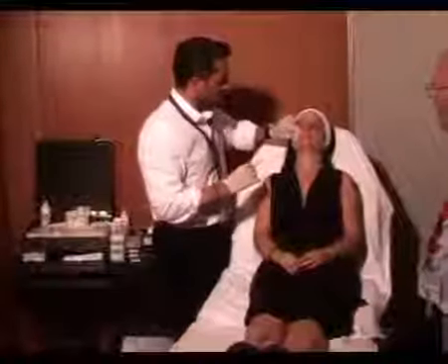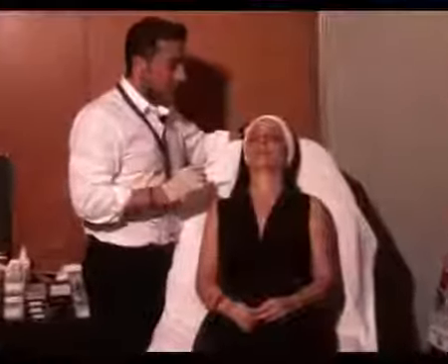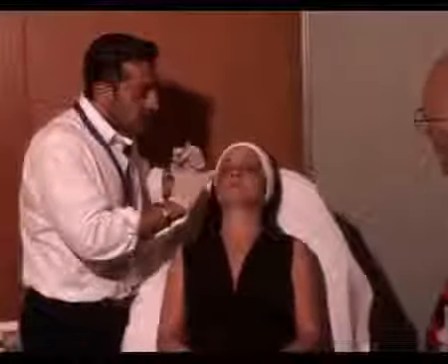Everything's fine? Okay. Alright, so as we're going to be injecting right now, we're mainly going to be injecting into the tear troughs. I'm going to use a needle here, okay? And remember, we pointed out 3 distinct areas. 2 of them are going to be medial to the mid-pupillary line, and 1 of them is going to be a little on the lateral side. So what we're going to do is the following.